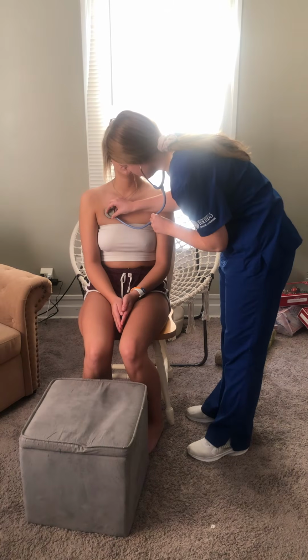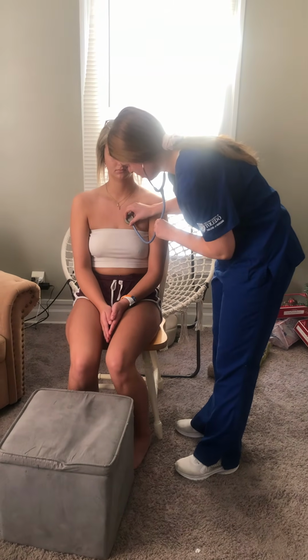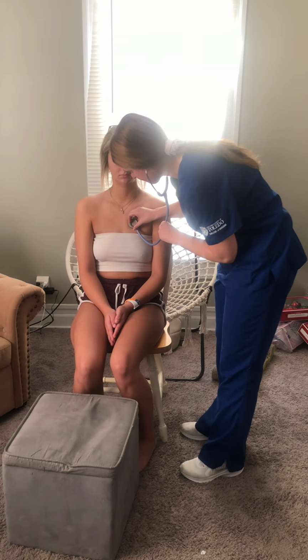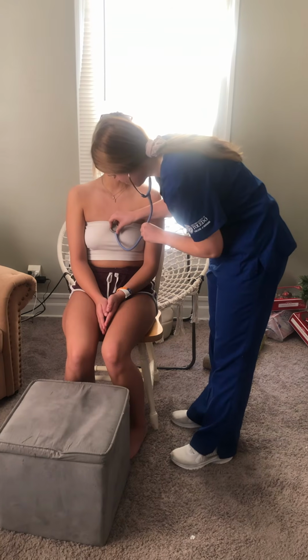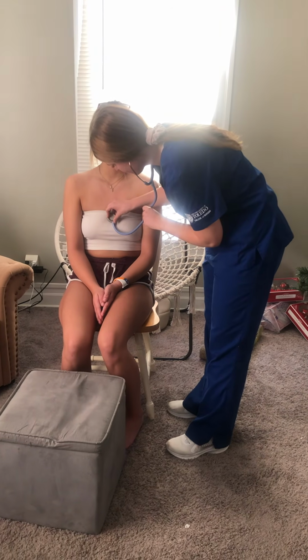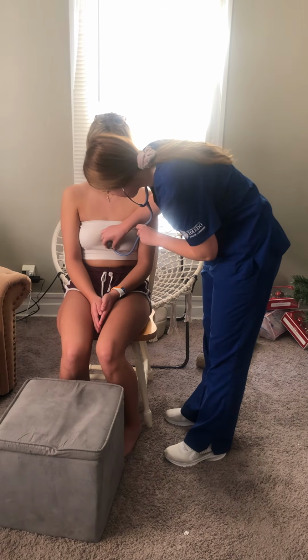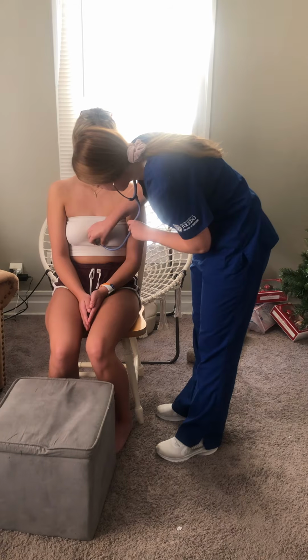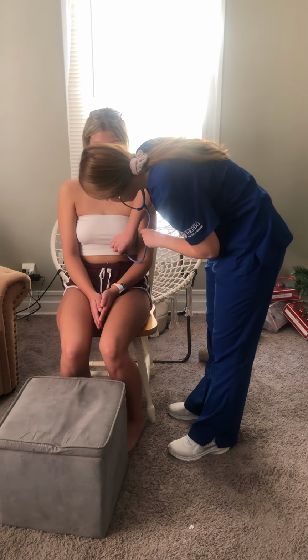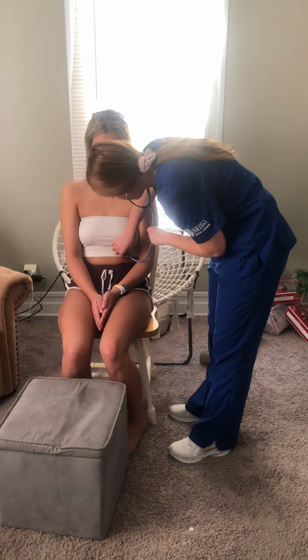And then we are going to move to the second intercostal space on the left side of the body, which is the pulmonic. And then we are going to move to the third intercostal space, which is Erb's point on the left side of the body. And then we're going to move to the fourth intercostal space, which is tricuspid. And then we're going to move to the fifth intercostal space, which is mitral. And this one we want to be more middle.